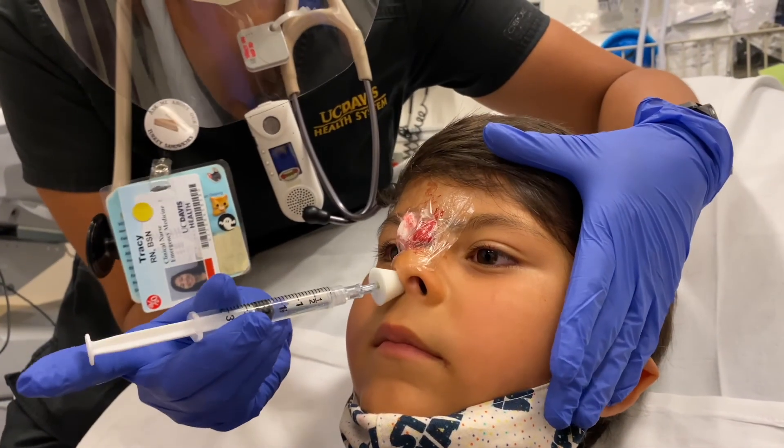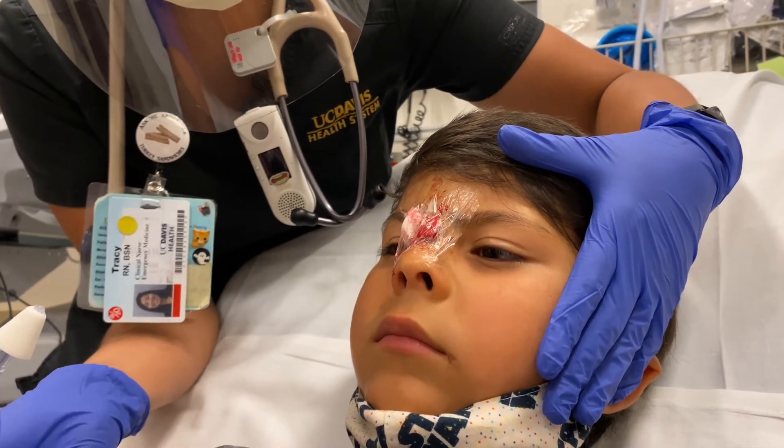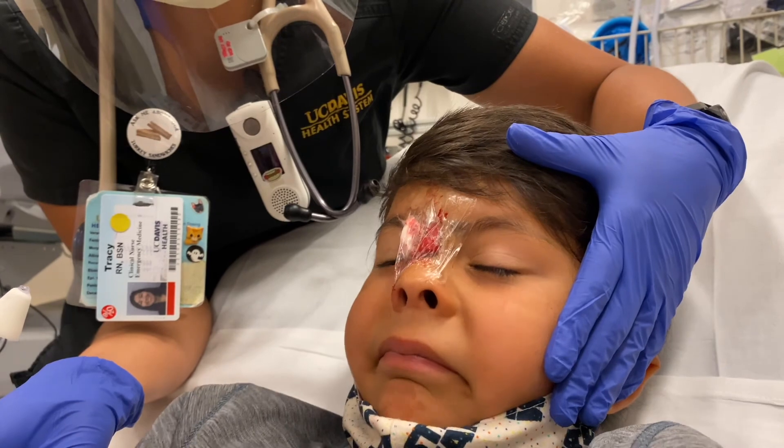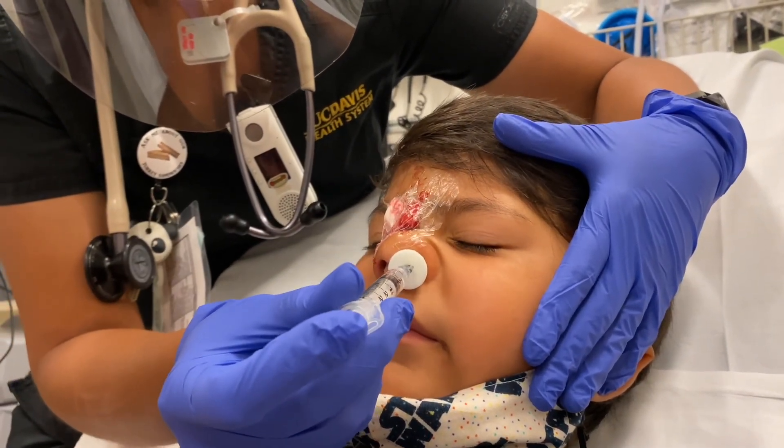Now, get a good seal, put that mucosal atomizer device all the way up in the nare and point it out to the right or to the left so it's pointing towards the tip of the ear just a little bit. And push fast on that plunger. We want to get about half in each nostril to optimize our absorption.